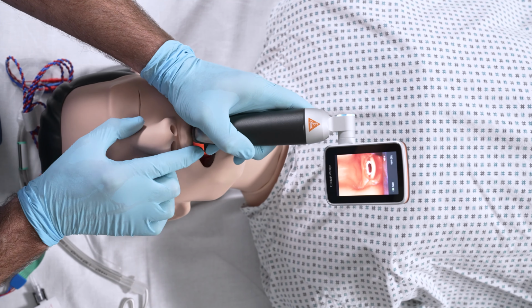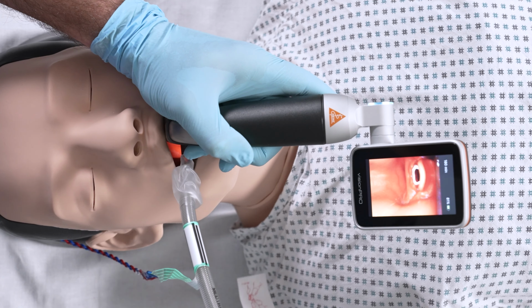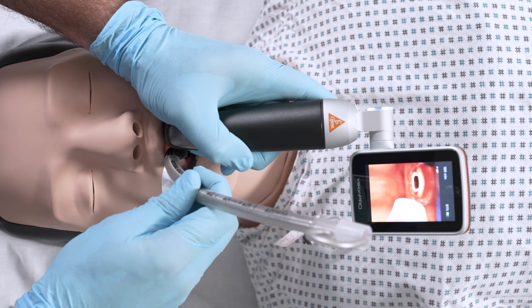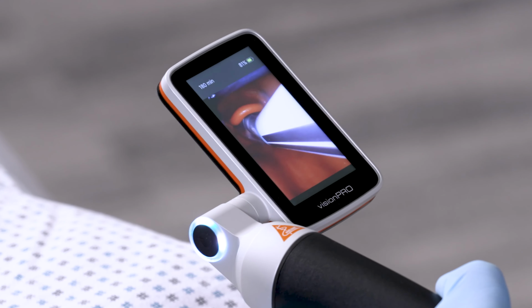I would say this is a percentage of glottic opening of 80%. And I can place the tube. Everybody can see what I'm doing. And we can perfectly see that the electrodes are placed correctly between the vocal cords. And this is very important.